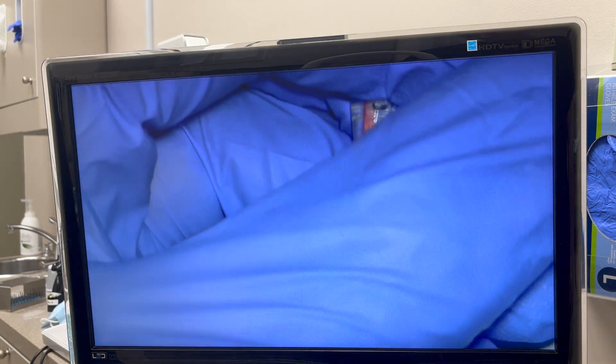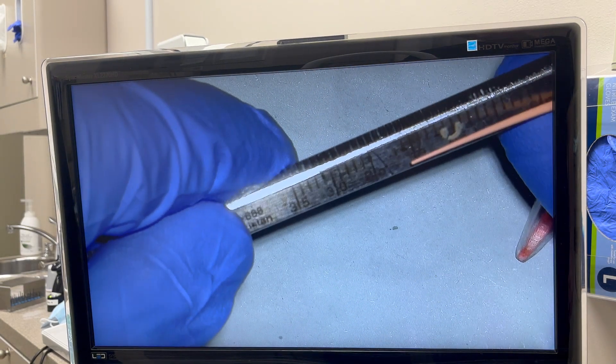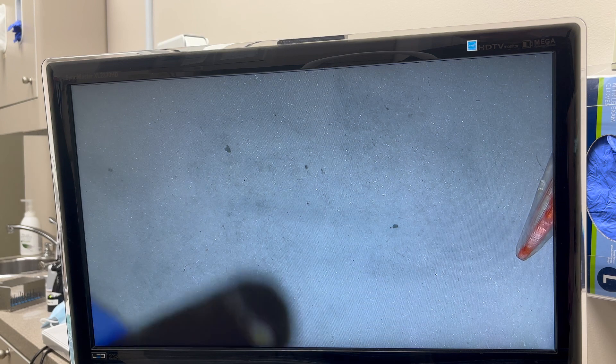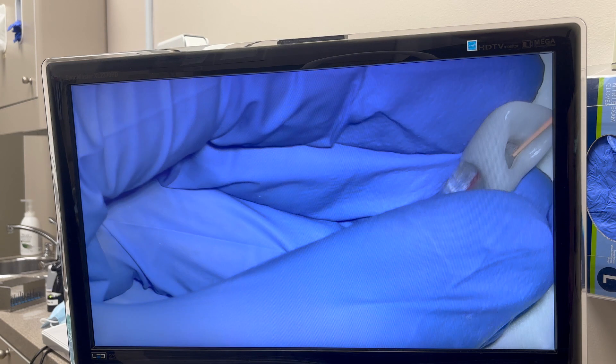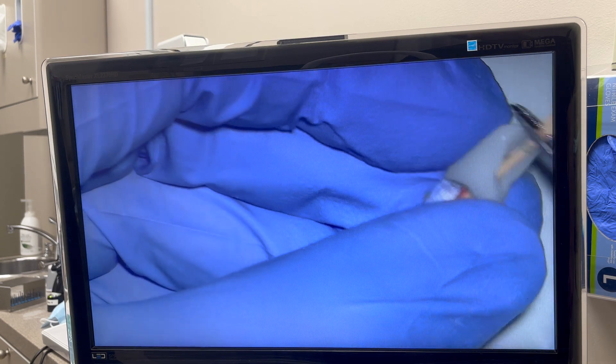A very common mistake that people do is they will take their gutta percha, measure it to the length, which is 24, and then put it inside the canal. You shouldn't do that. What you need to do is grab it anywhere, put it into the canal, and go all the way in as far as possible until you have a tugback.